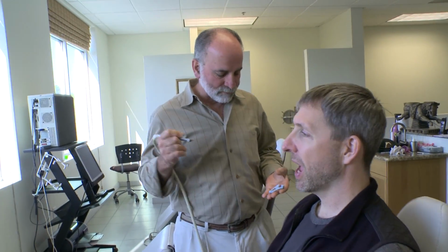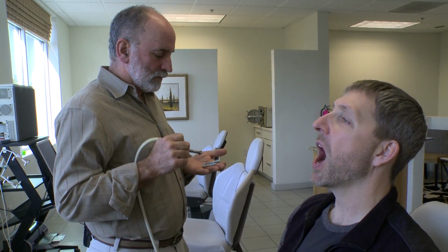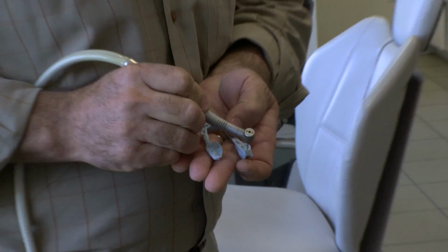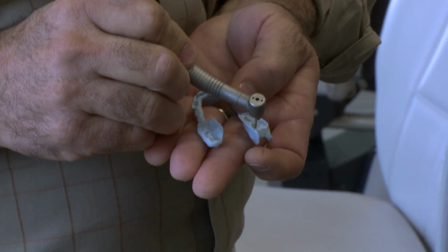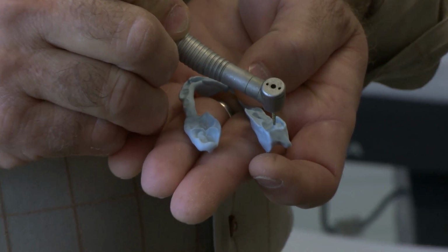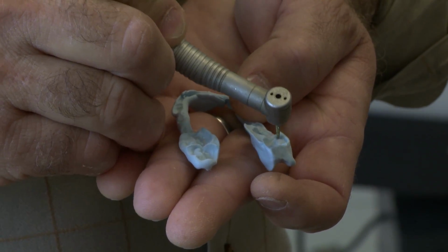All right, Dave. Now we're going to adjust that back crown. So you're going to grind down the high points. Correct. You should either be hitting on this little ridge through here or this valley through here, but not out over. If you hit on this ridge properly, there's an equal amount of light on this side and this side of that line. And this one's heavy on the outside.